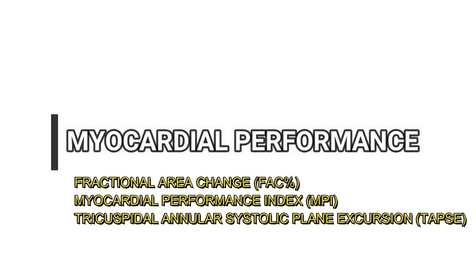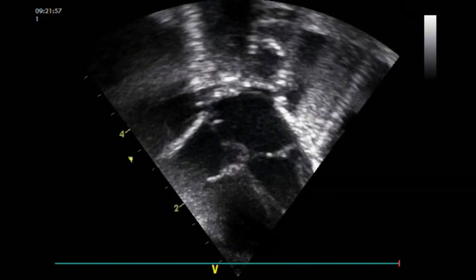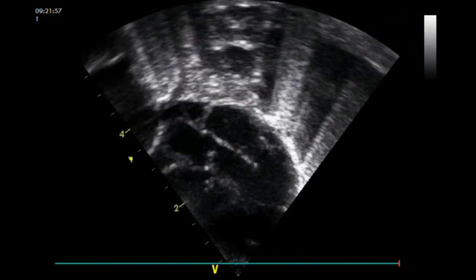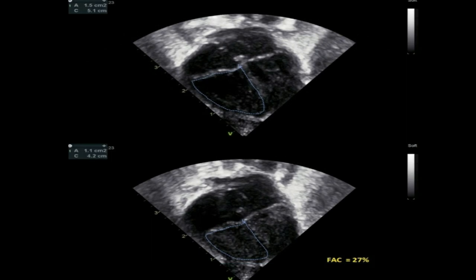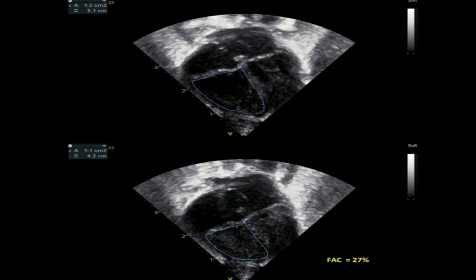Right ventricular function in pulmonary hypertension can be assessed by measuring the fractional area change, myocardial performance index, and tricuspid annular plane systolic excursion. Fractional area change is a planimetric measure of the ratio of systolic to diastolic area in the apical 4- or 3-chamber view, by manual tracing of the endocardial border of the right ventricle. The entire ventricle — including the outflow tract and lateral wall — must be visualized, and trabeculations should be included within the cavity. Normal values range from 25 to 45 percent in preterm and term infants, and median values of 19 percent are associated with the need for extracorporeal membrane oxygenation or death.